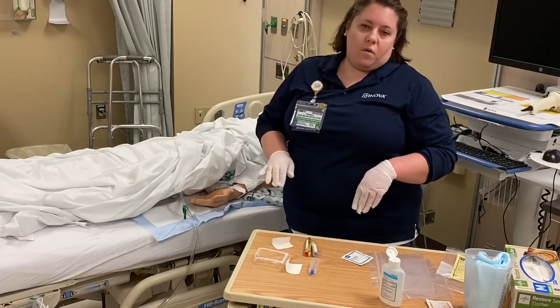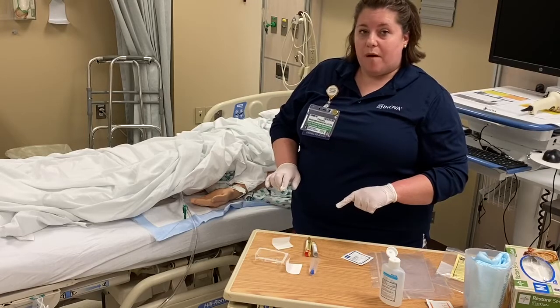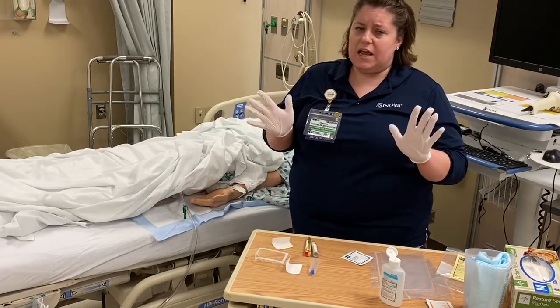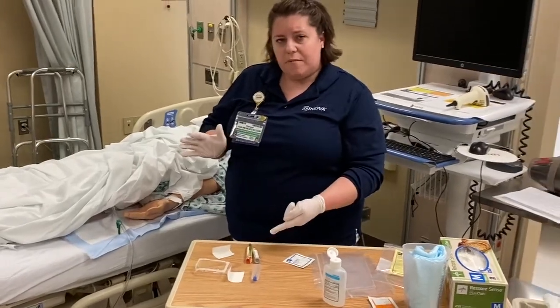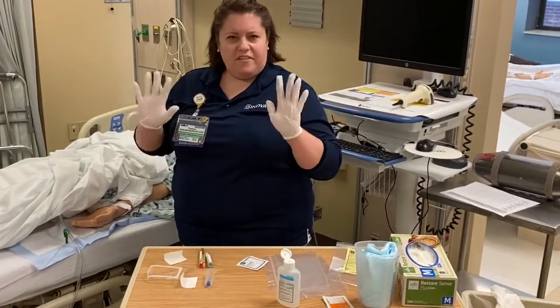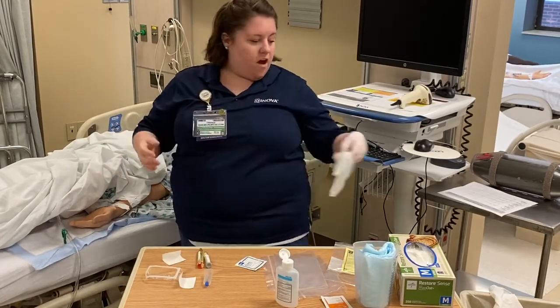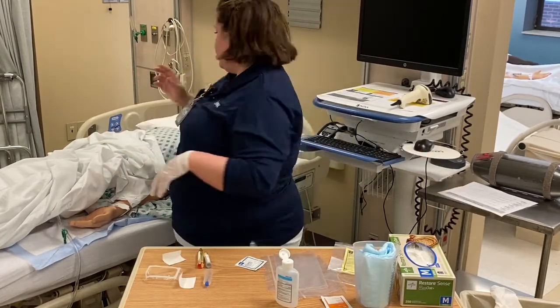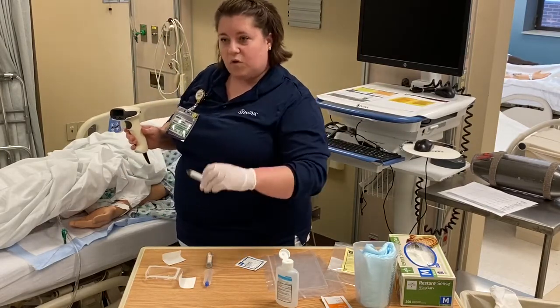Now, what I want to do is scan my tubes to make sure the lab knows that they're coming. But I have gloves on, and I can't go to the computer with gloves on, but I'm also going to be picking up my tubes, so I don't want to have two hands without gloves. So what I'm going to do is take one glove off, and I'm going to use this hand to hold my scanner, and then this hand can hold my tubes.